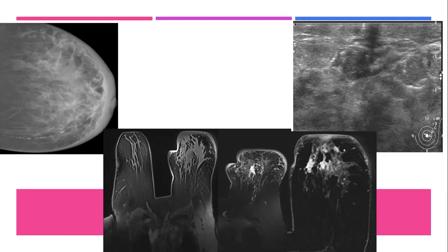No, on MRI, we have three types of enhancing lesions. One is mass. If it is not mass, it will be non-mass enhancement.